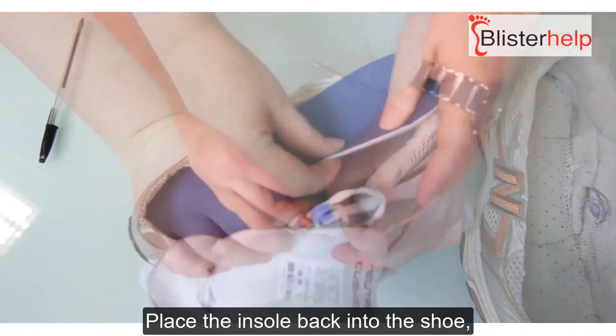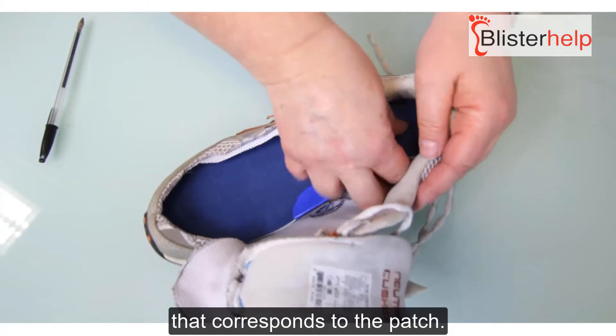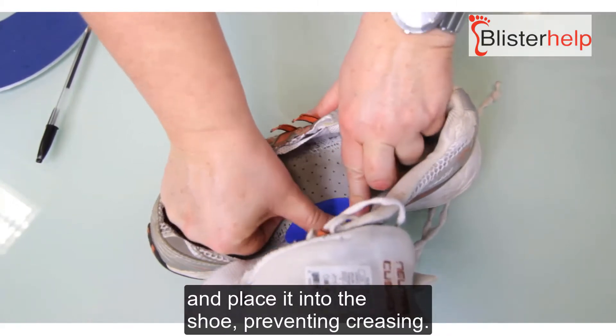Place the insole back into the shoe and mark the area of the shoe that corresponds to the patch. Remove the insole and place another oval patch in that spot on the shoe.